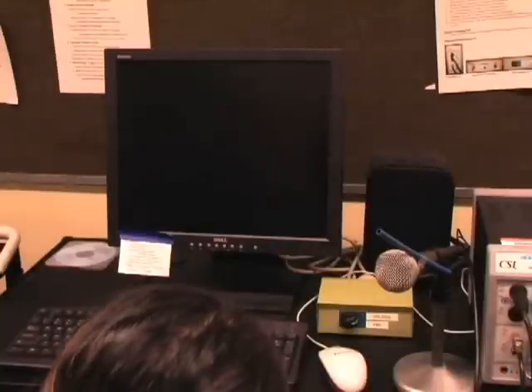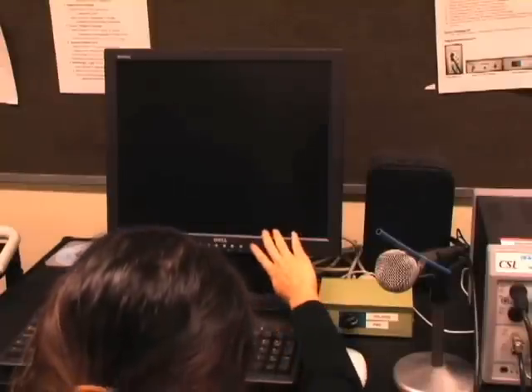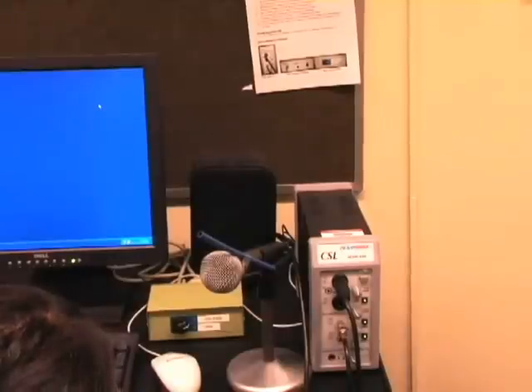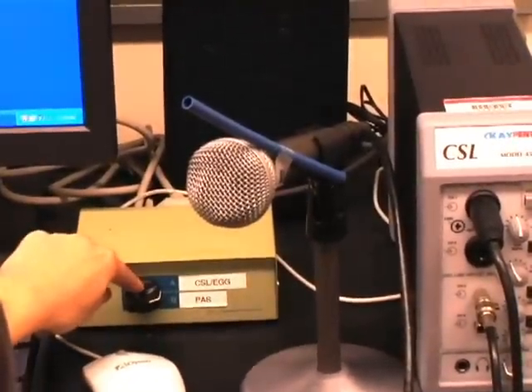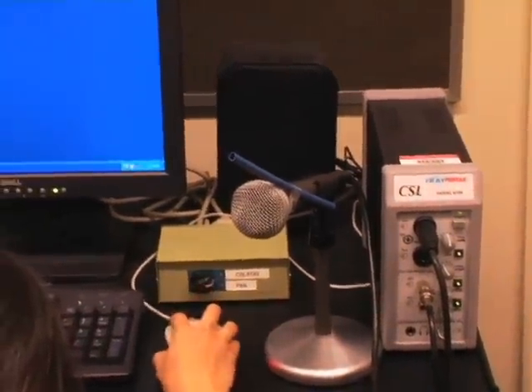We will now demonstrate the use of the CSL MDVP. Step 1: Turn the computer and monitor on. Step 2: Turn on the CSL hardware to the right of the monitor by pressing the power button on the CSL tower, and turn the knob on the tan box to the left of the monitor to CSL/EGG. Now click on the CSL model 4500 icon on the desktop.